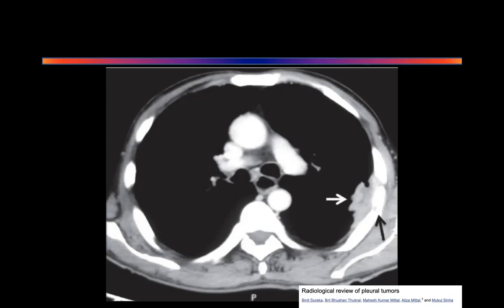There's a fracture there, sir. Pathology. There is a fracture there. The fracture and the presence of the nodule tells you what is happening. Hematoma. It's a bone tumor. Pathological fracture, sir. Pathological fracture.